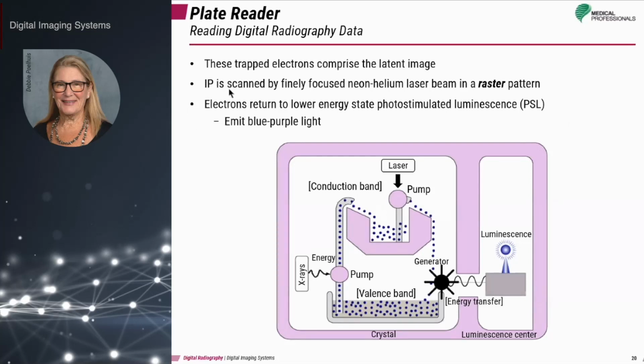And the imaging plate is scanned by a finely focused helium neon laser beam in a raster pattern. A raster pattern is also known as an image or bitmap, and it is when a plate is scanned from left to right and top to bottom.